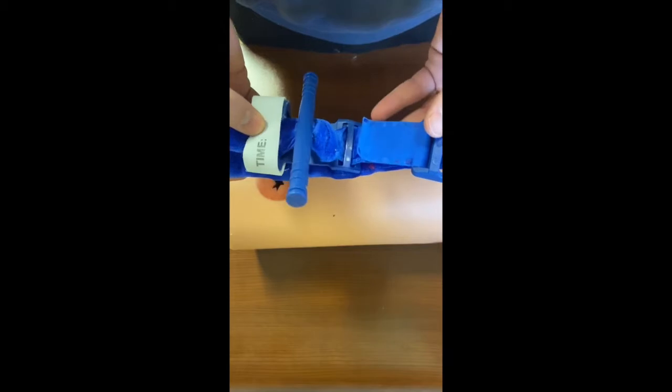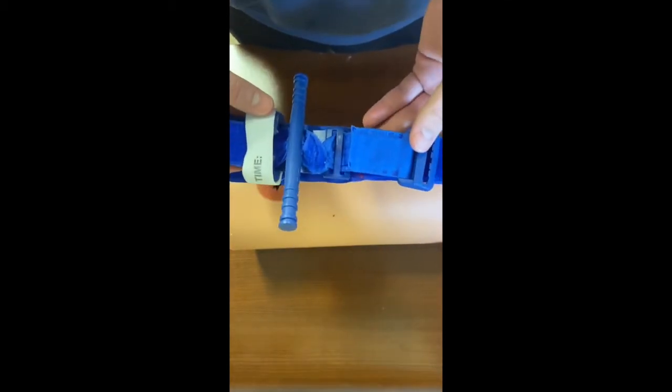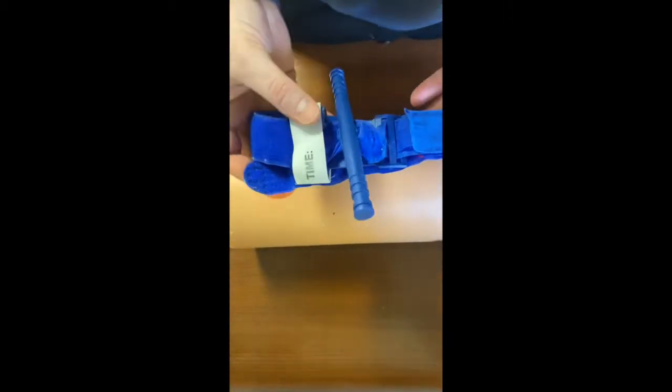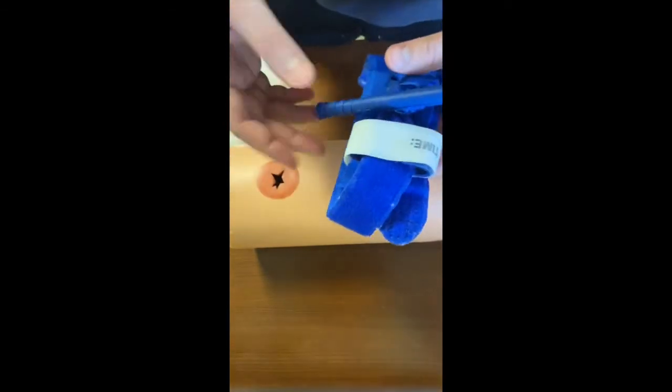Tourniquets are used in what we call life over limb, so we're going to use a tourniquet to preserve life, because if one of these is not applied, there's a good chance that an individual could bleed out. We commonly use tourniquets on arterial bleeds. You can know if it's arterial by spurting blood instead of oozing.